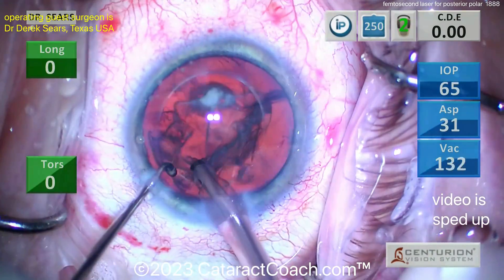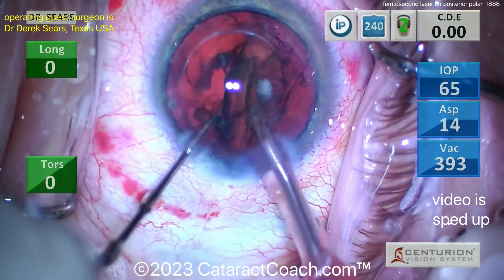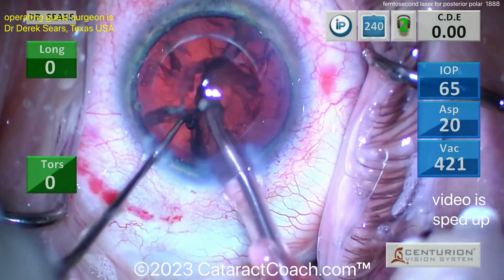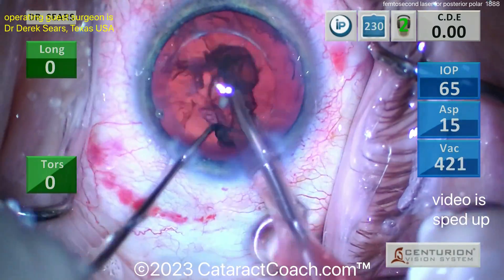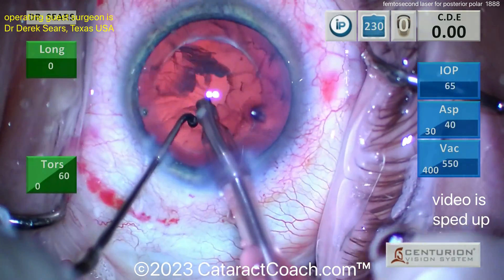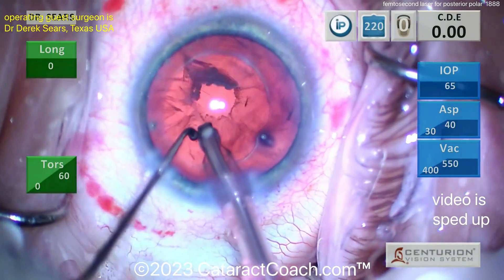This is very soft — you've got to barely hold it with the vacuum power and bring it up. It doesn't rotate because there's no hydrodissection done. Very nicely done, fully mobilized, beautiful job. Taking that last piece out. At this point I'd definitely put some viscoelastic or at least BSS to prevent the bag from collapsing as you come out of the eye.